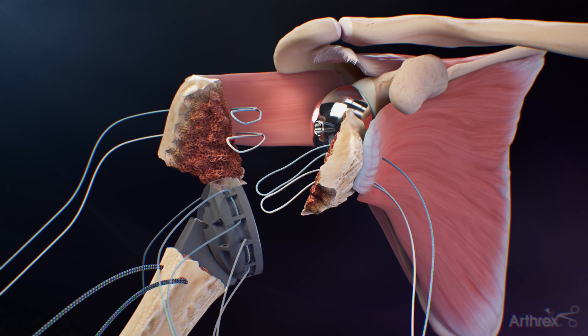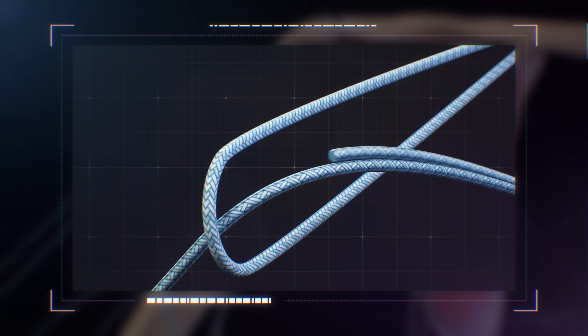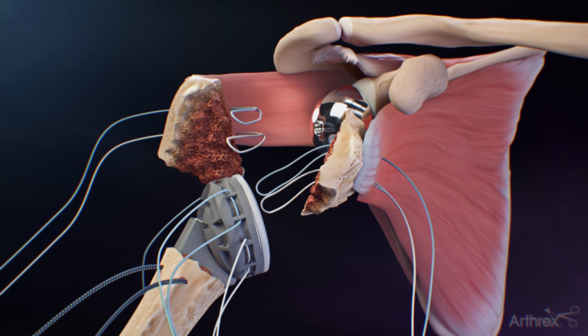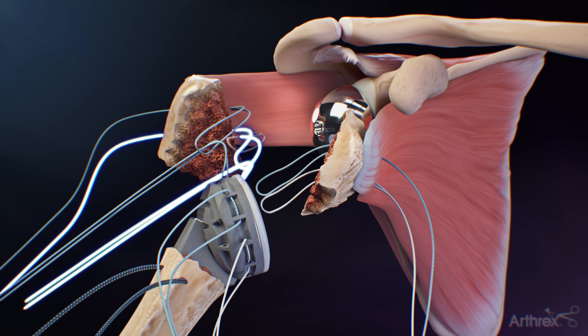Implant the humeral prosthesis and place the final humeral insert. On the posterior side, take the suture tails from the blue fiber tape and feed them into the blue fiber link looped end. Repeat the previous steps for the tiger tape and tiger link. Then shuttle the sutures through the greater tuberosity.